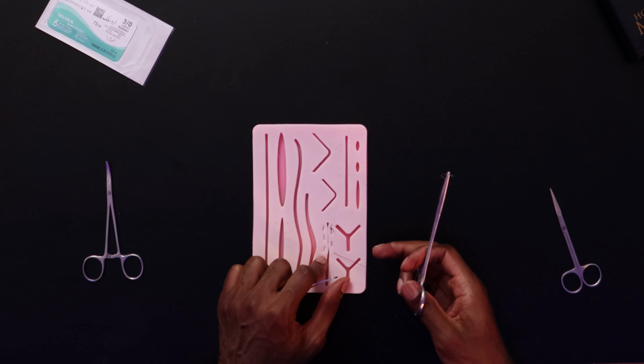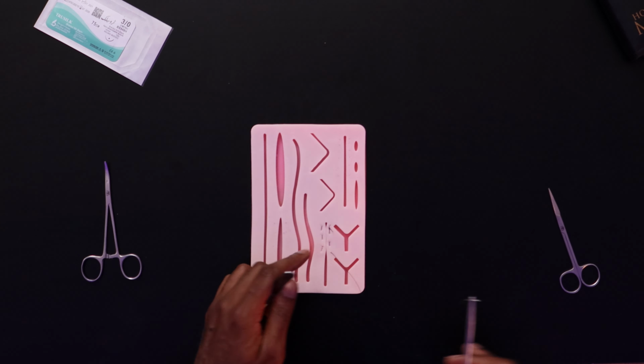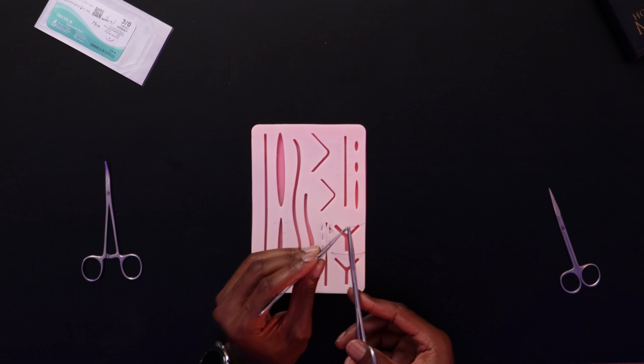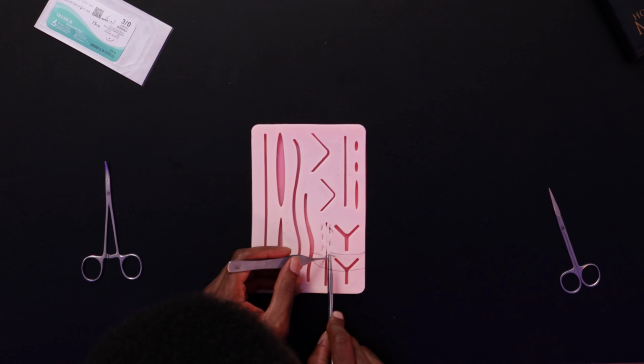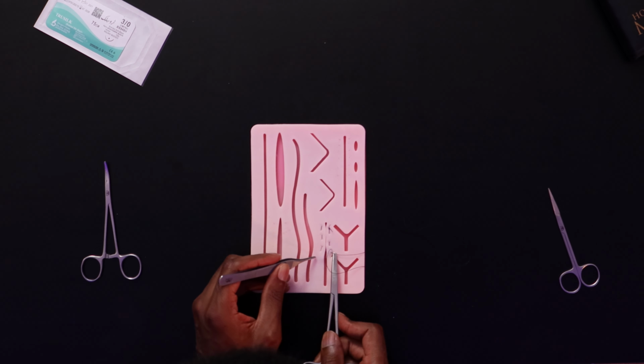Once again, pulling as tight as you feel you need to close the wound. I'll do a few more passes without as much instruction for you to follow along.